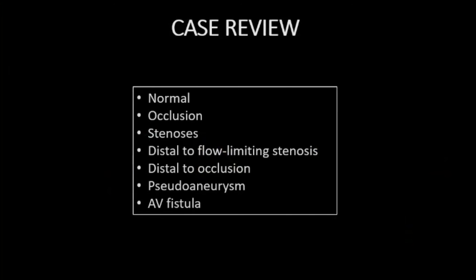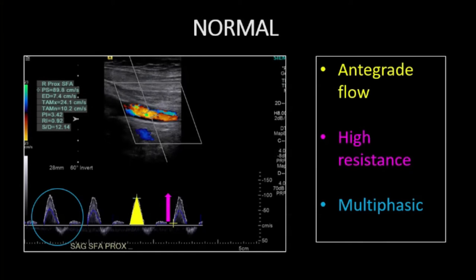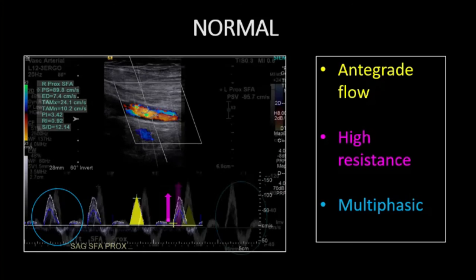Let's begin our case review. Here's a normal superficial femoral artery. Antegrade flow with systole is detected with a sharp upstroke, multiphasic signal is subsequently detected, and the tracing indicates a high resistance artery, which is typical for the SFA.